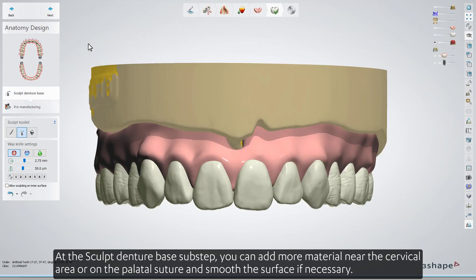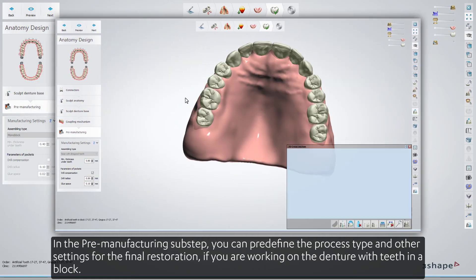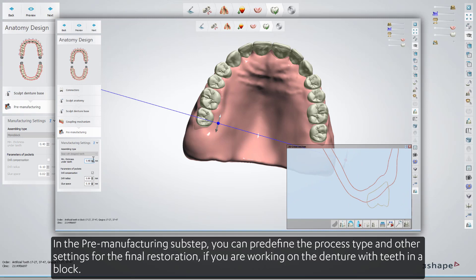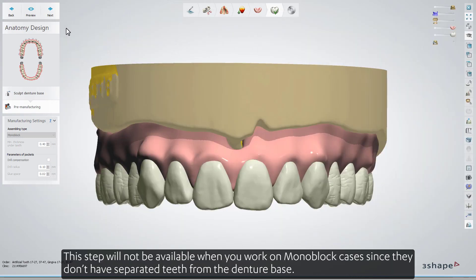At the sculpt denture base sub-step, you can add more material near the cervical area or on the palatal suture, and smooth the surface if necessary. In the pre-manufacturing sub-step, you can pre-define the process type and other settings for the final restoration, if you are working on the denture with teeth in a block. You can also preview these settings by clicking the Preview button. This step will not be available when you work on monoblock cases, since they don't have separated teeth from the denture base.